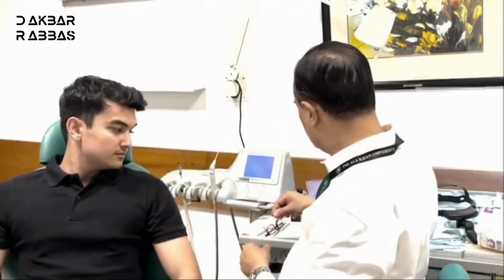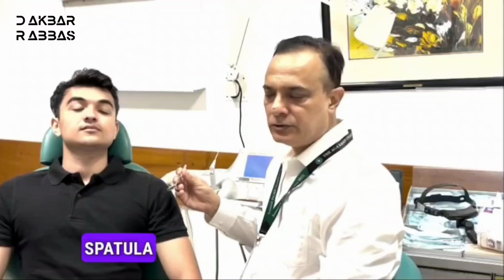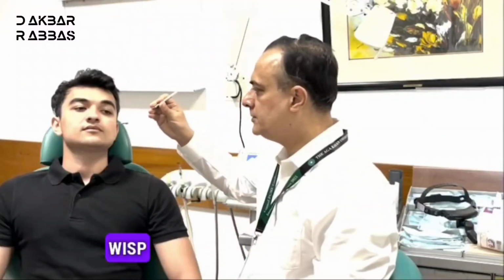Now we move on to the mirror test, or you can use a metallic spatula in a similar manner. We use this like the cotton wisp test.